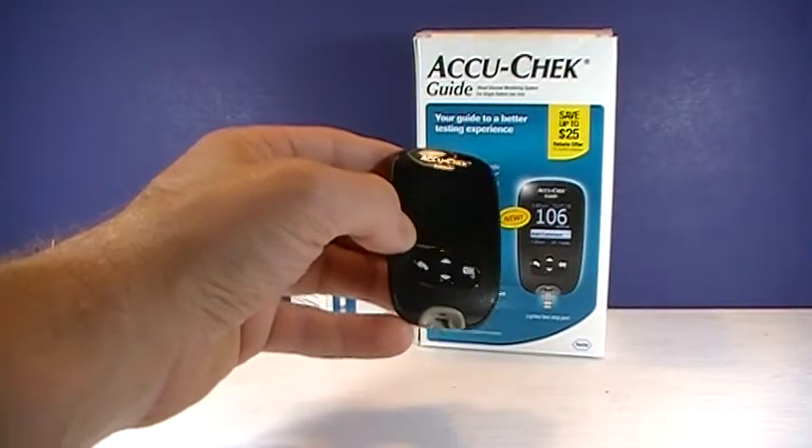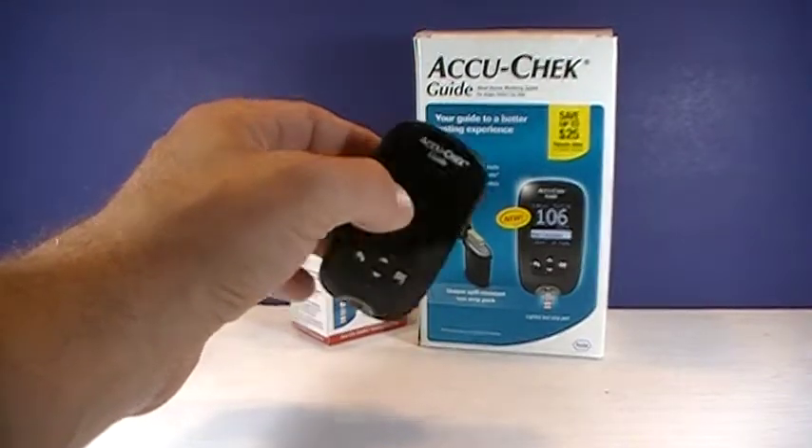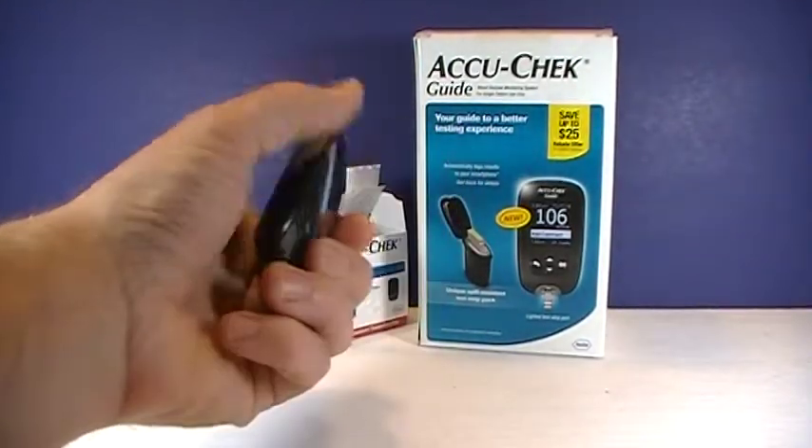Hi, this is Josh, pharmacist with pharmacisttips.com, here with a quick tutorial on how to change the batteries and set the time in the AccuCheck guide.